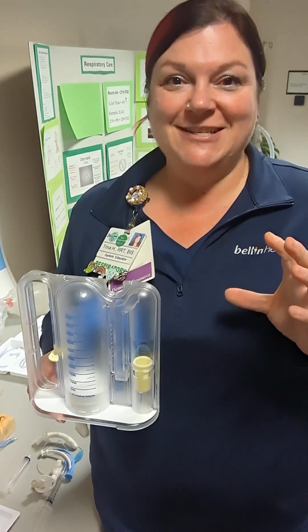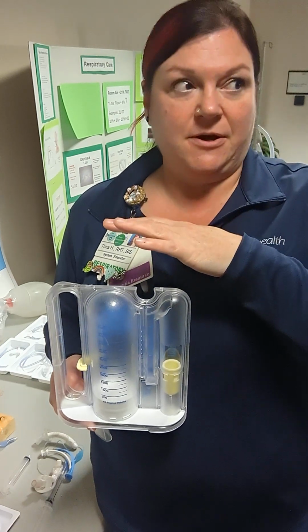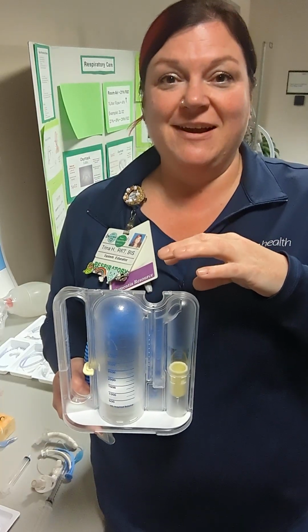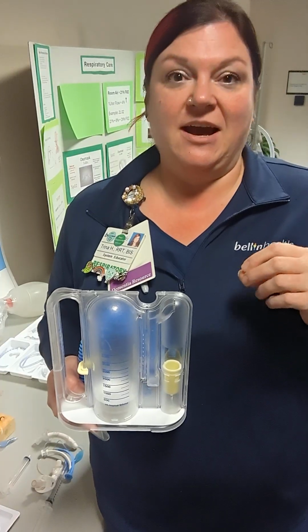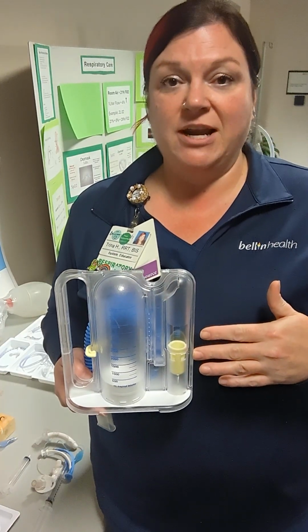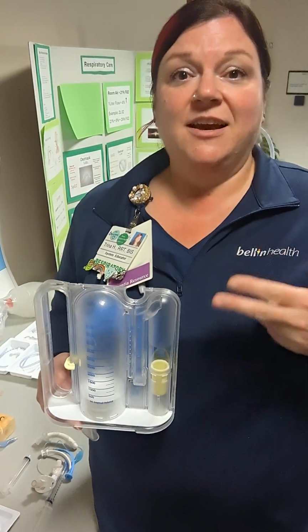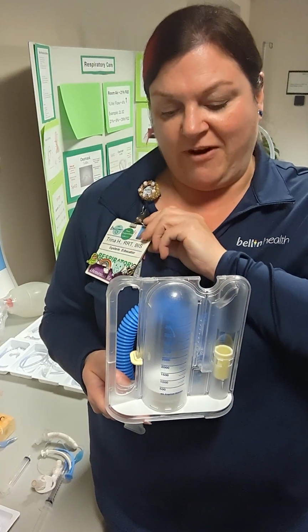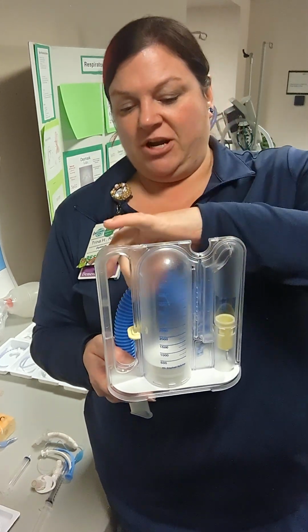Now, that is all neatly defined for us in a chart that is a piece of paper included in the packaging for these devices. And if you're like me, I have a tendency to open it up and perhaps just throw it away. So be mindful that if you don't know what the patient's goal is already, take a look at that chart and determine, based on their age, their height, and then gender at birth, what our goal volume would be. So for me, I know I'm 5'5" and 3/4, almost 5'6". My goal is about 1,800.